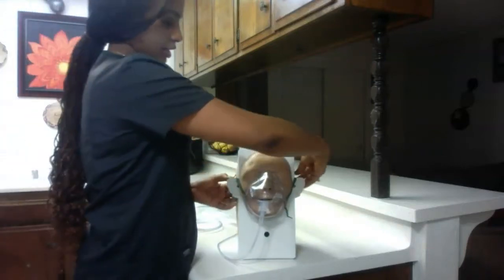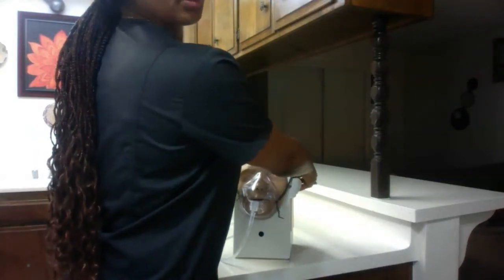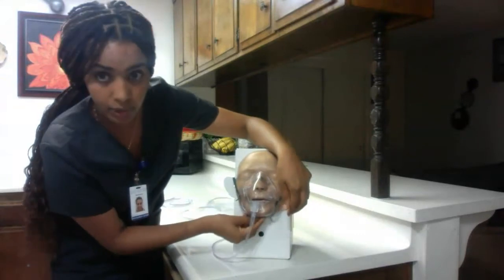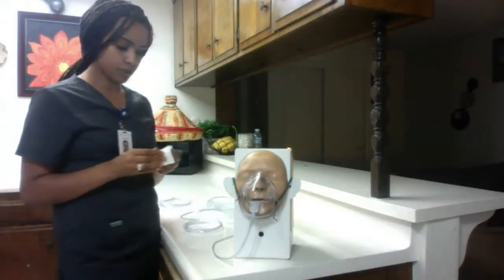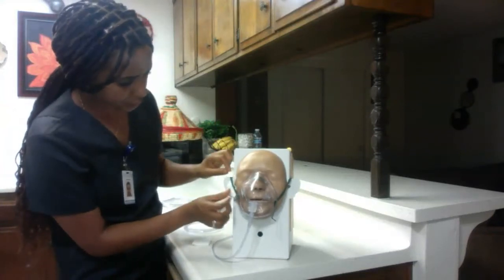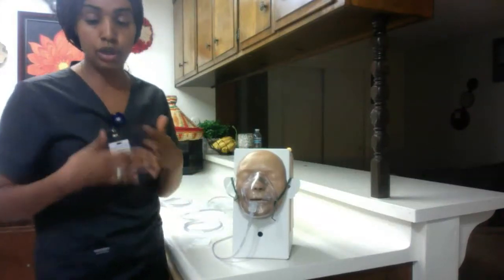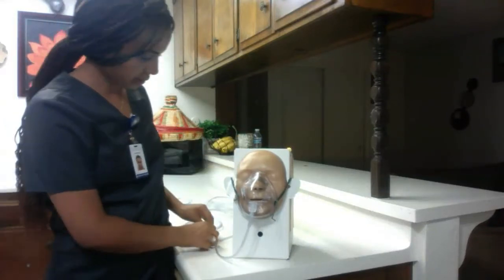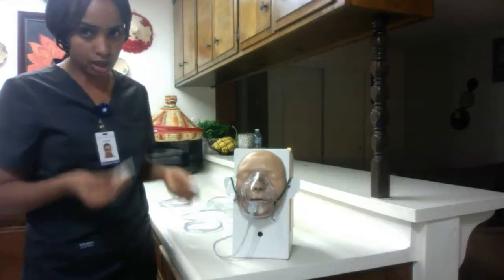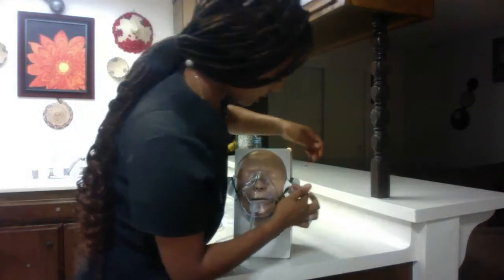We're going to adjust the mask at the back and make sure it's tight under the chin. We're going to use a 2x2 gauze under here because going forward this can irritate the skin, and we do not want any skin breakdown. That's the reason we use the gauze — and if needed we can place it anywhere the skin might get irritated or break down.